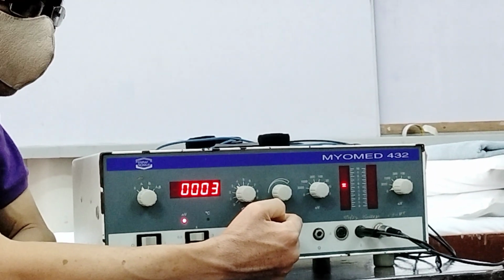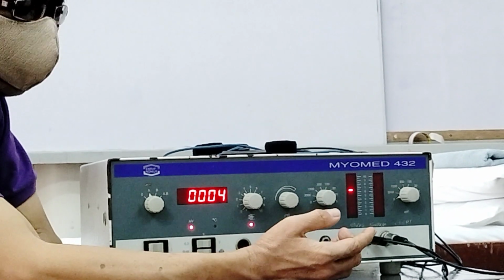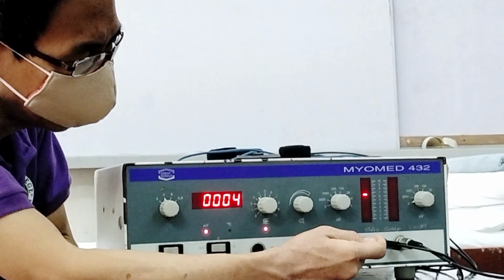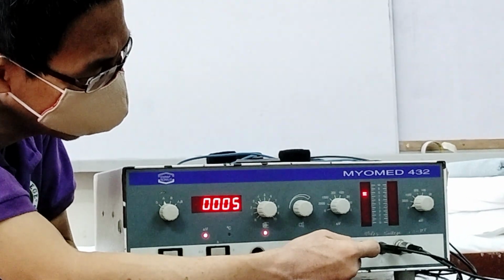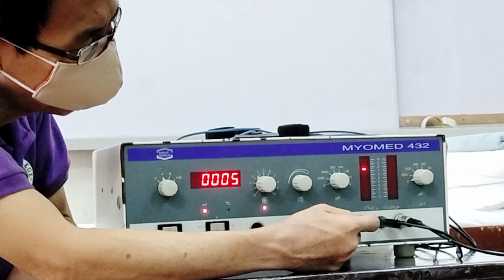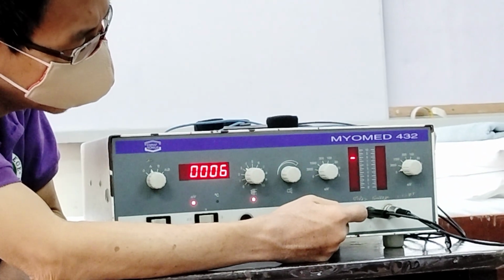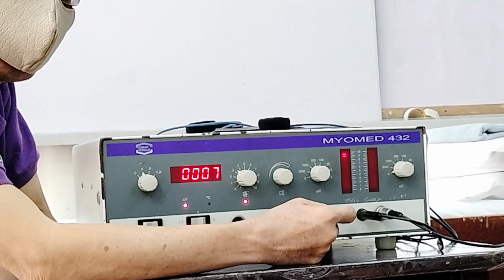Okay? So level 9. Sir, sige sir. So now sir, try to bend your wrist. Sige, nag-bend ang patient sa wrist. Sige, bend pa yun sir. So as therapist, you just have to encourage the patient. Sige sir, bend pa yun sir. Hapit na tayo sa 9 sir. Sige, bend pa yun sir. If you notice, nagikapoy na ang patient, then you can rest. Ask the patient to rest.